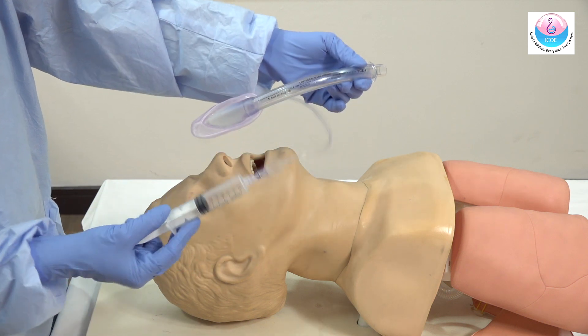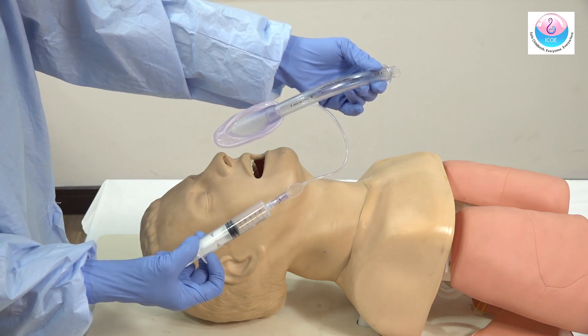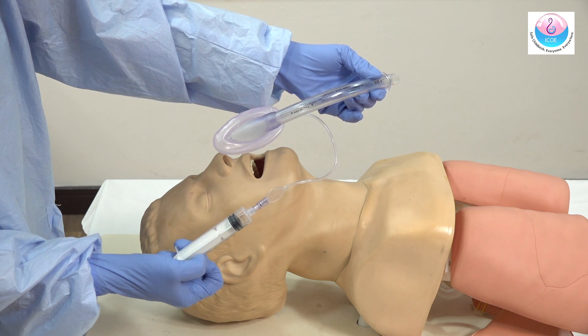The laryngeal mask is a useful airway adjunct. Select the correct size, inflate and deflate the cuff to check for leaks.